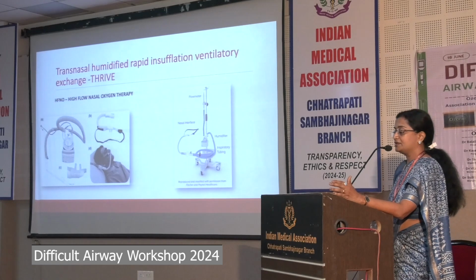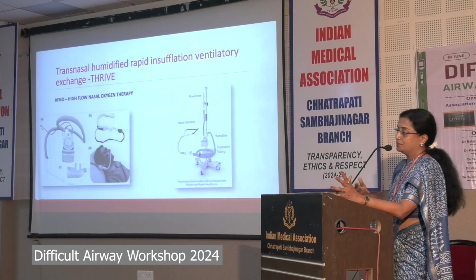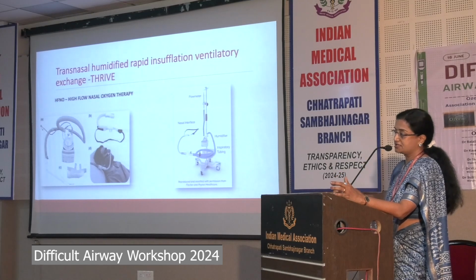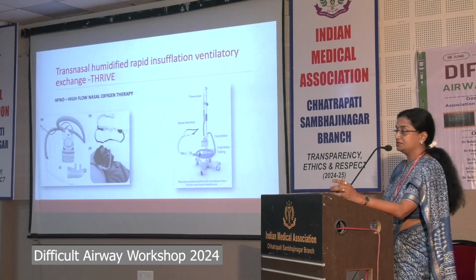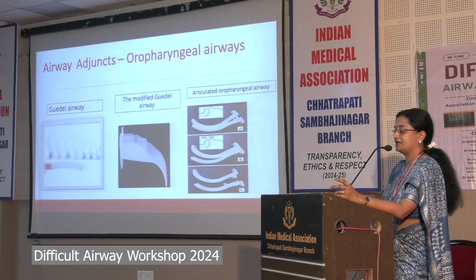Nowadays THRIVE is available post-COVID in most of the ICUs, and in the OR you can ask whether your HFNO is working. Please ask for it. Otherwise, we do not know whether this hospital has it or not.